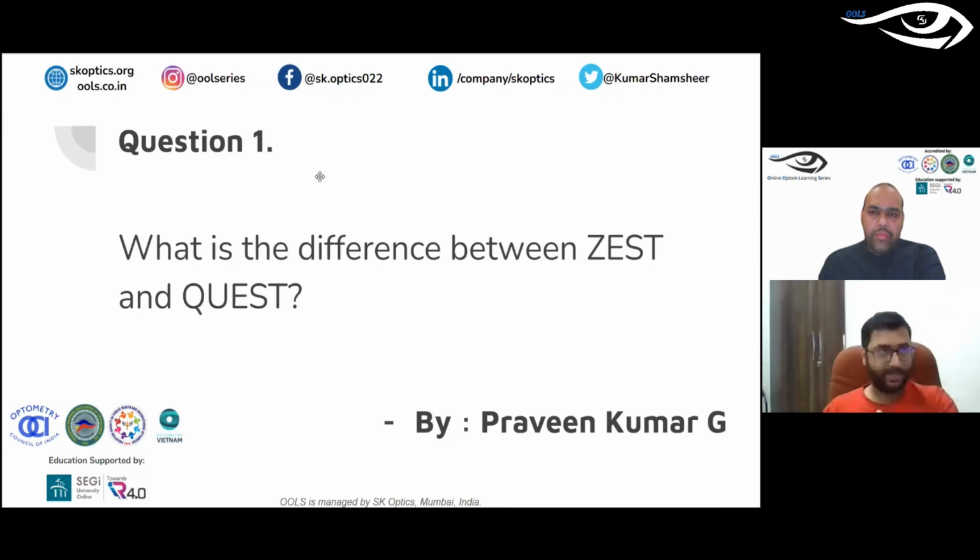And still, if they are doing it poorly, ask them to come the next day, to have a cup of coffee, to come back and then do it. That's the only way. That's right. So make sure that the test results are reliable before you make any decision. Again, coming back to the baseline point, what we have been telling since the beginning, right?